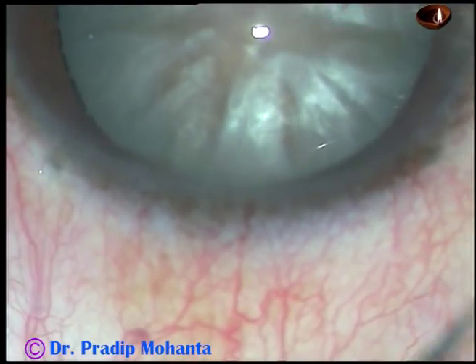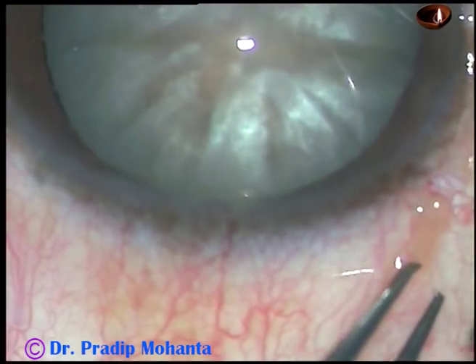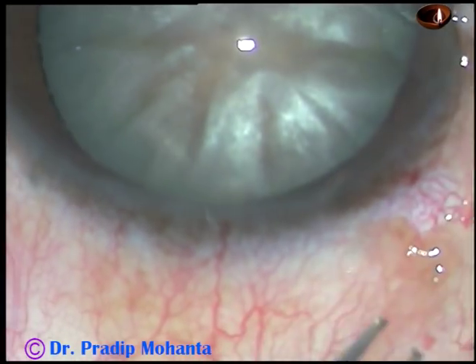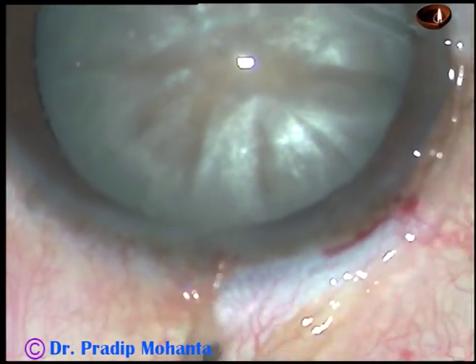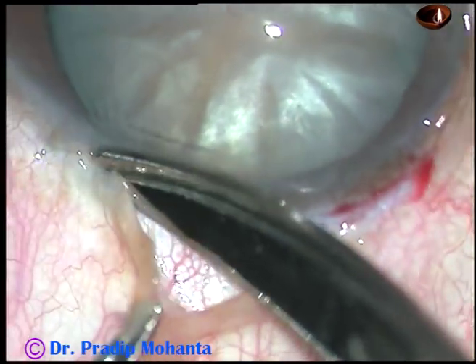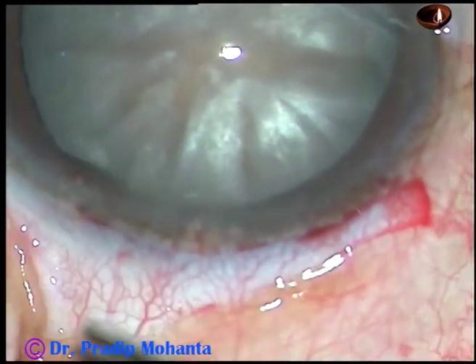Conjunctival peritomy for a length of about 10 mm is being done. Make a small radial cut and then just go along the limbus and cut at the limbus. The conjunctiva is not dissected too much behind, just this much.